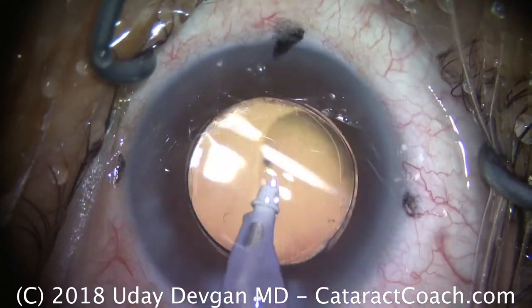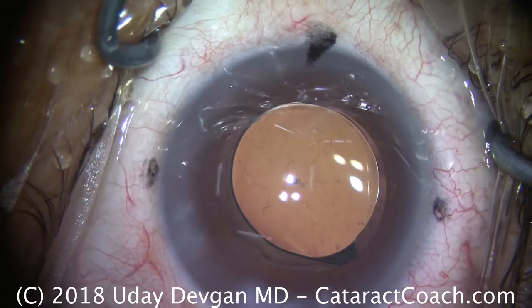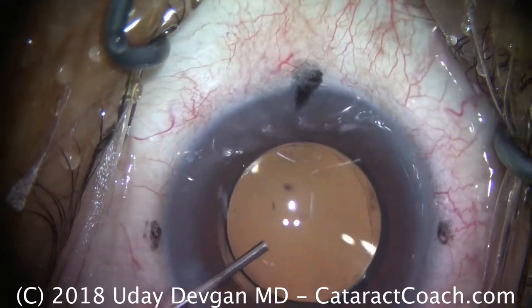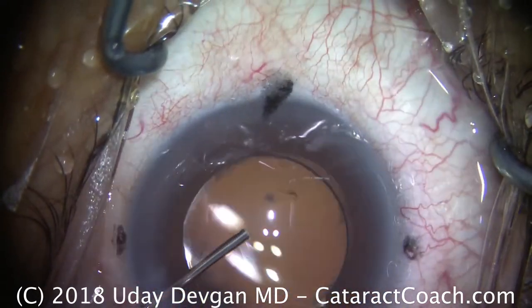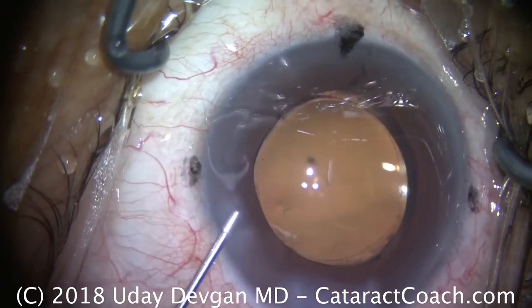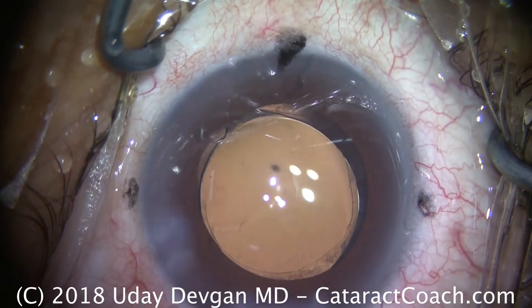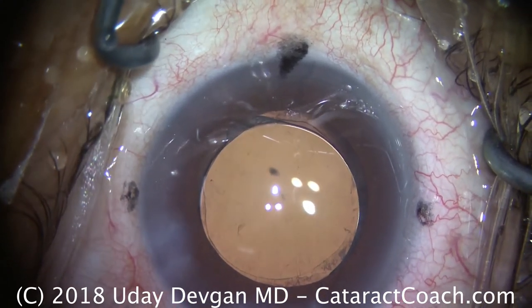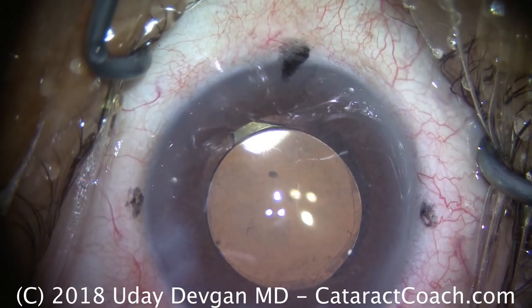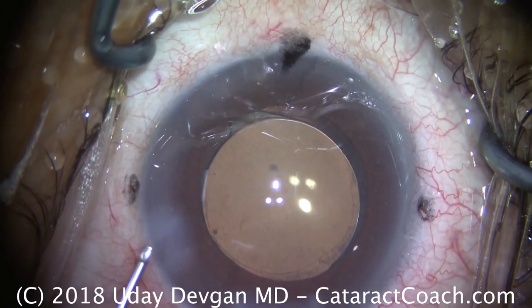Time to seal up the incisions. We're relatively gentle here — I don't like a ton of hydration, just a little bit right at the incision. We'll go in through our paracentesis and wash out to make sure there's no retained viscoelastic in that angle. We re-center the lens and make sure it's nicely centered in the pupil, then seal up the paracentesis. In this eye, we're also going to put some medication — preservative-free triamcinolone — for a good anti-inflammatory effect for at least a few days. We put in a total dose of less than a milligram. The patient will have a little bit of hazy vision initially, but that'll clear up fast. We add a little more saline to seal the incision, and finally we're going to end with some preservative-free moxifloxacin in the corneal stroma and on top of the eye.